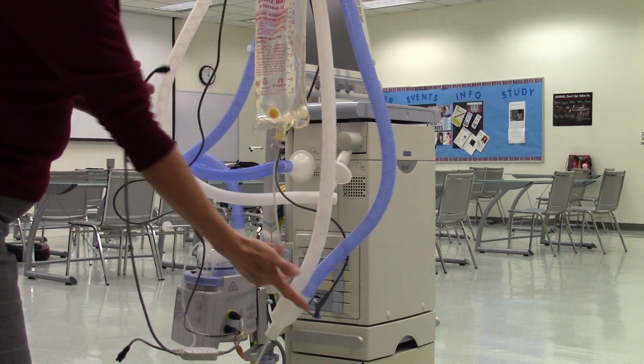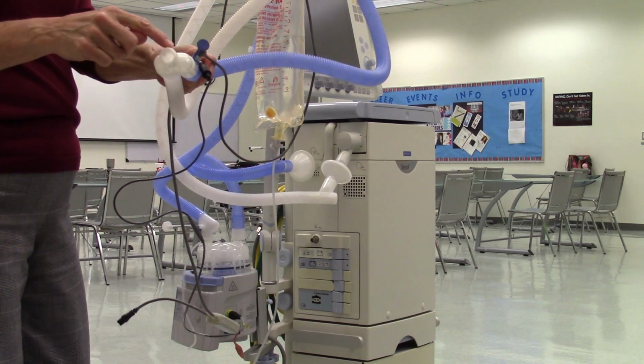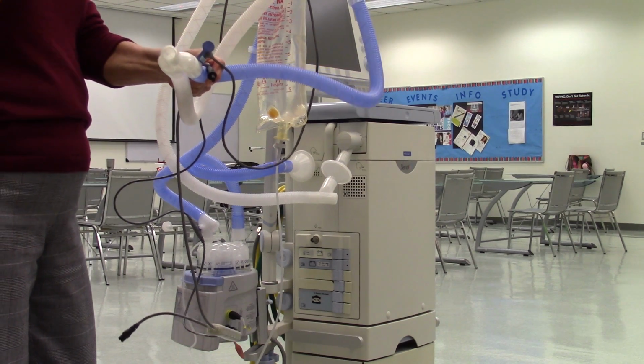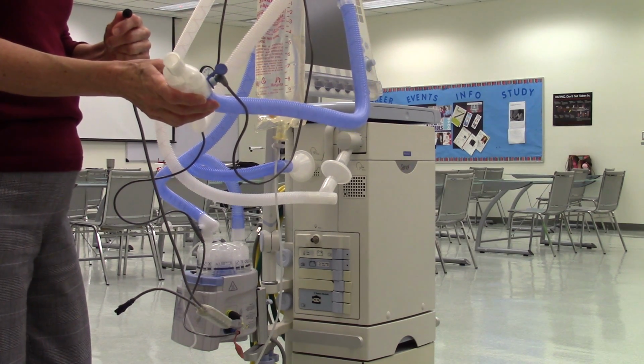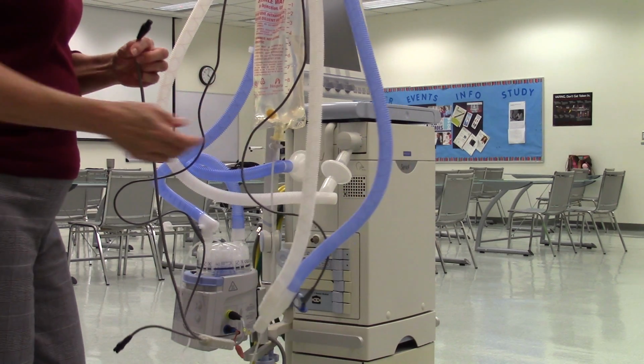And for the patient end, it likes to warm it up to about 39 degrees Celsius here, because it cools a little bit as it goes through the Y and through the endotube, and gets inside the lungs. Once it gets inside the lungs, it will be about 37 degrees, body temperature. So technically it's going to be a little warmer at the humidifier. That's what you're looking for? Yes. This is a travel through all that stuff.